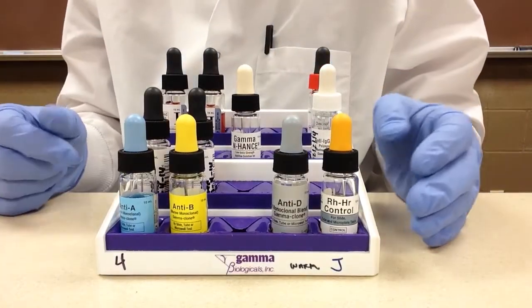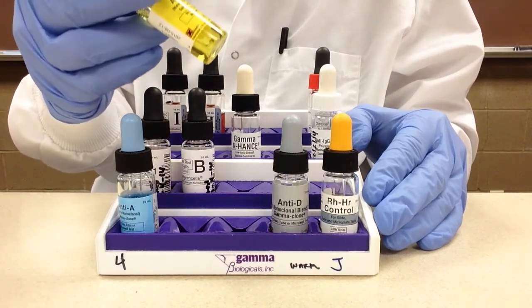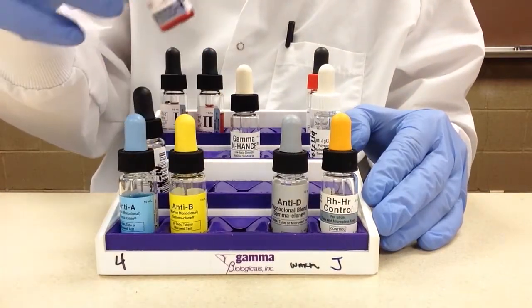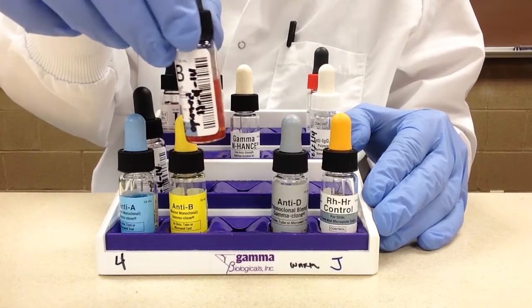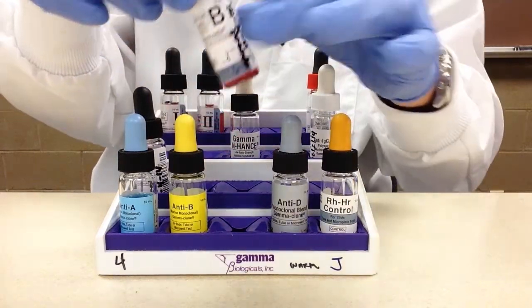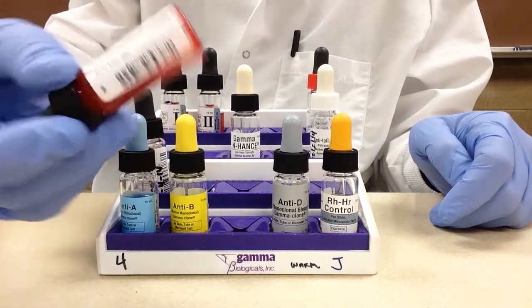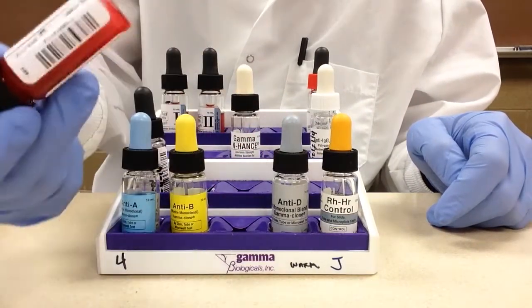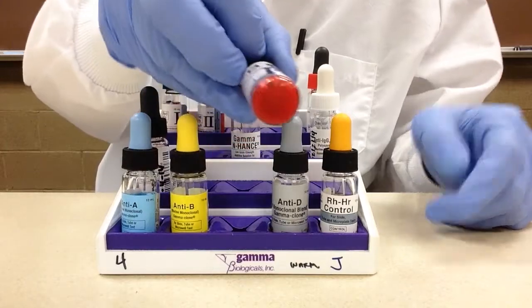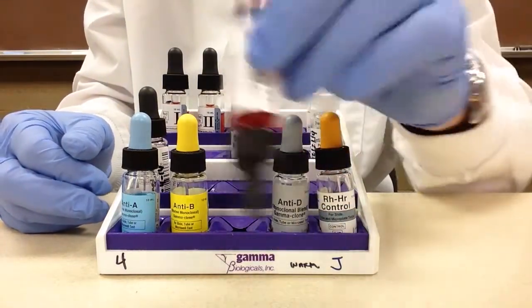When it comes to using reagents, we always want to mix them before use. This is especially important when using reagents with cells, because you can see here that red cells settle on the bottom with a clear liquid on top. We don't shake these since that could damage the cells. Instead, tilt the bottle gently until all cells are resuspended from the bottom.